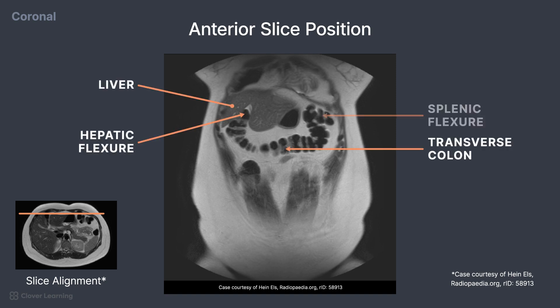and the splenic flexure visible on the opposite side. The rectus abdominis muscle again is visible, this time more inferior, but still just under the subcutaneous fat.